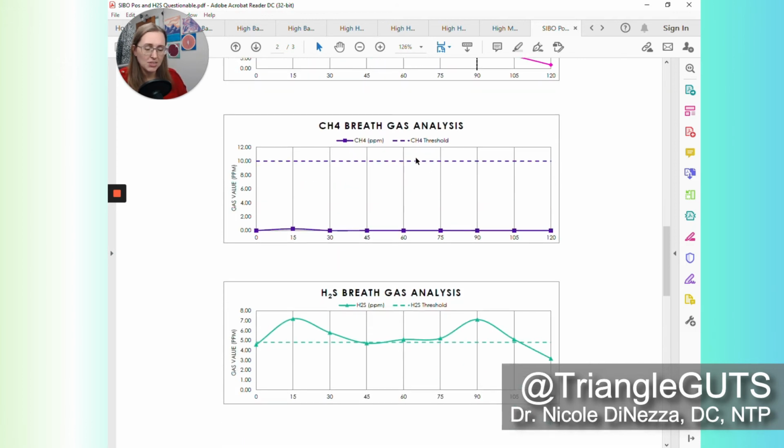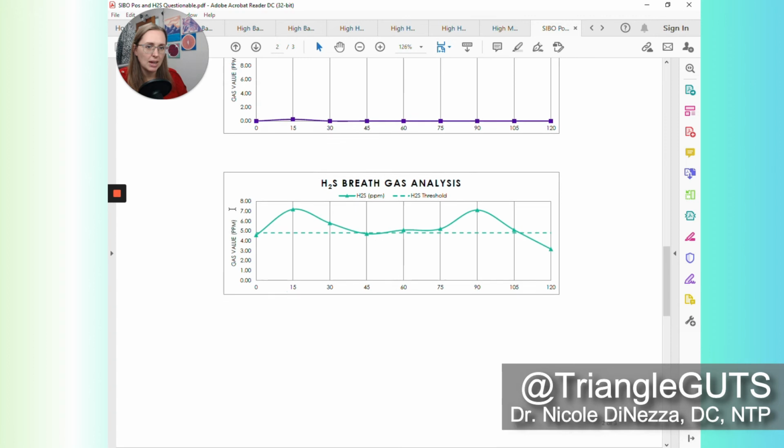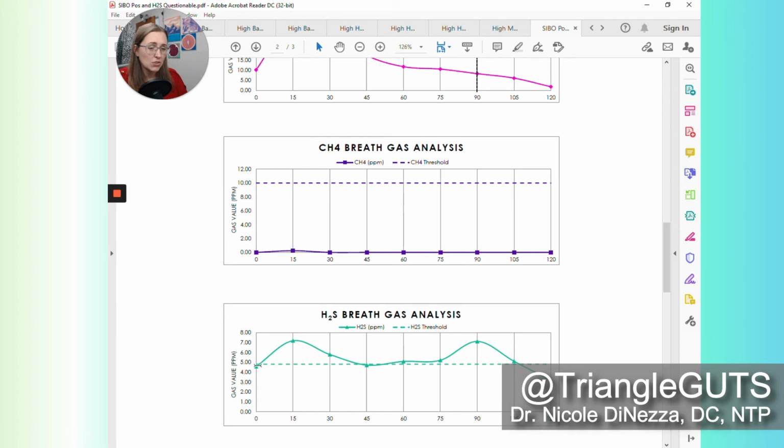And then we can see the other two gases. Methane is virtually non-existent, so that's clearly negative. And then you can see yet again, this one's kind of questionable because we go from basically, let's see, that looks like 4.5 or maybe 5 up to about 7, and then it goes down, and then we get a little bit of a peak again right around the 90-minute mark. So I would say this person definitely has hydrogen overgrowth and questionable hydrogen sulfide involvement for this particular case of SIBO. You can see that they clearly have an overproduction of hydrogen sulfide, but I'm starting to think that this might be a twofer.